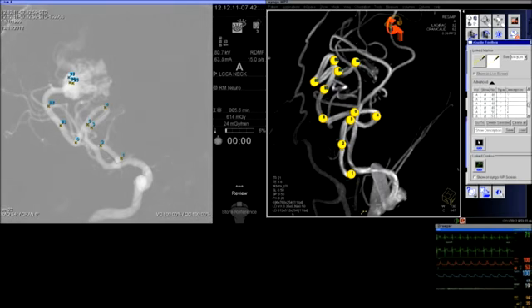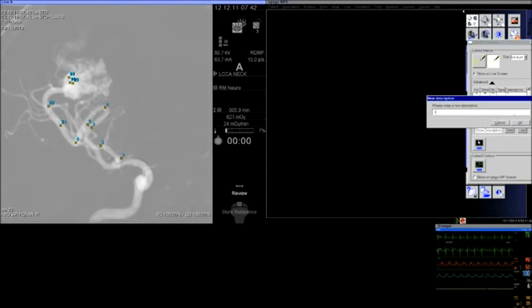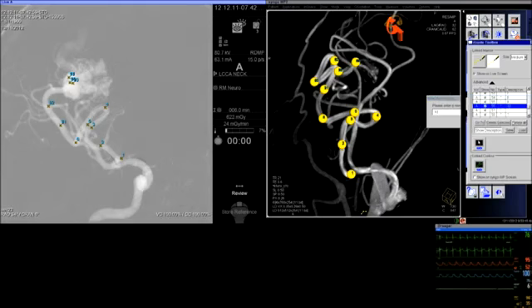Sometimes if this is not easy to do, like in this case, you see the microcatheter went into the wrong path, so now you redirect, and sometimes in these cases we may have to change and use a Synchro 10 microwire to add a little bit more ability to redirect your catheter and find your path.